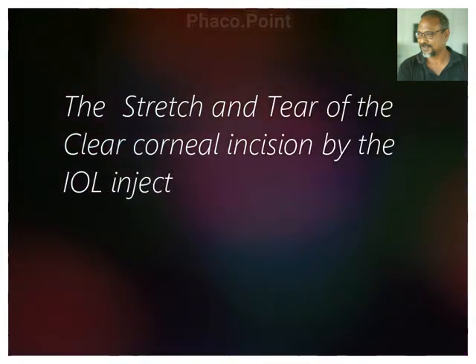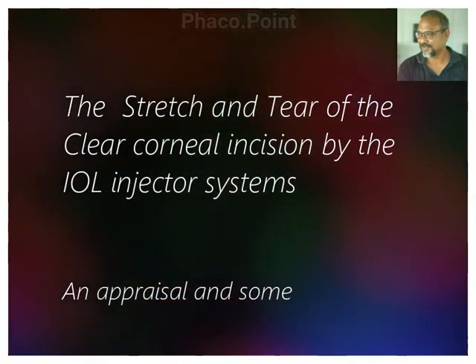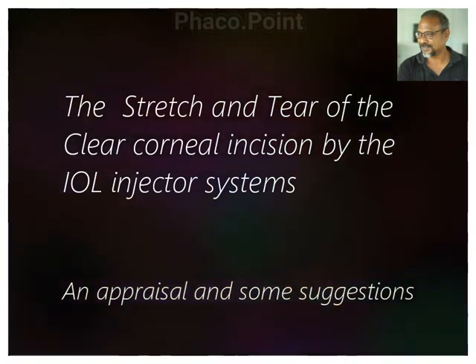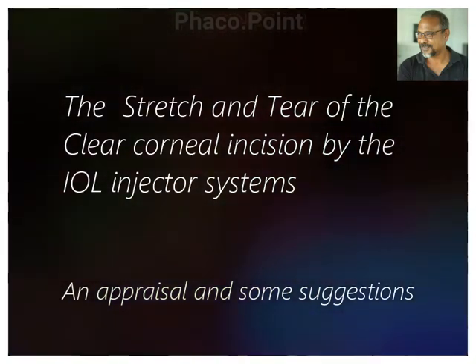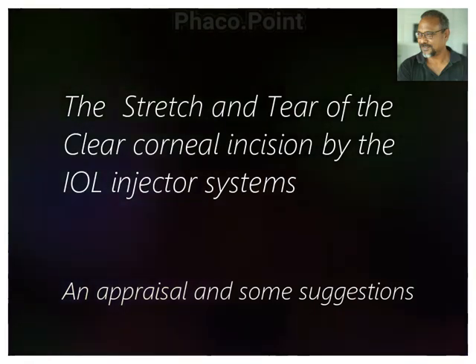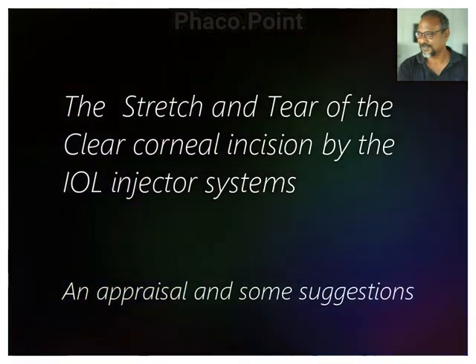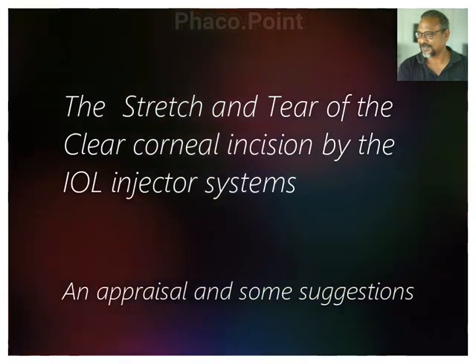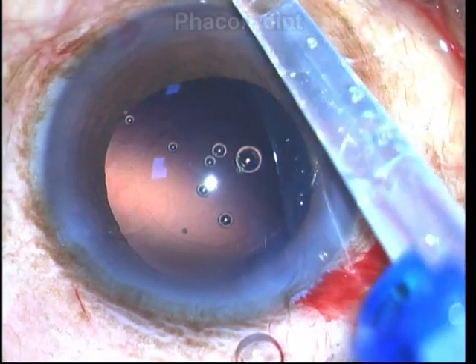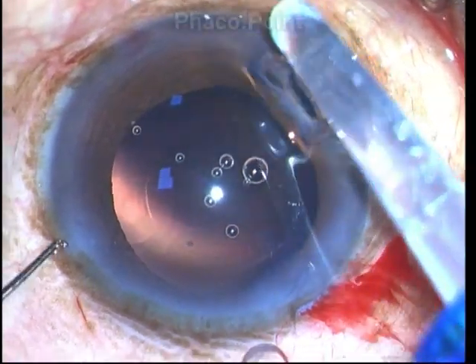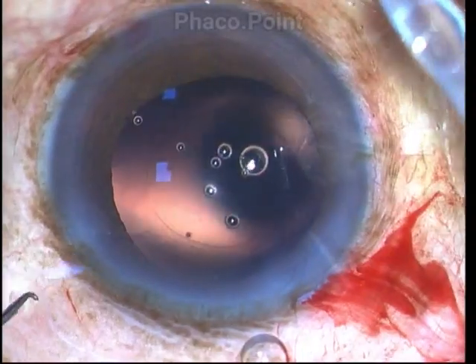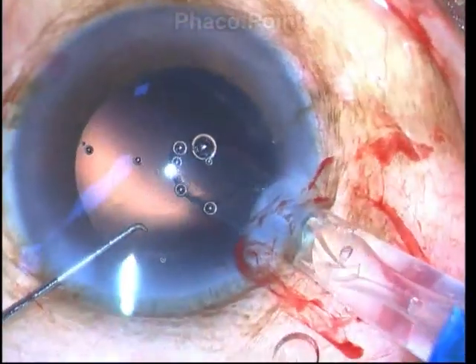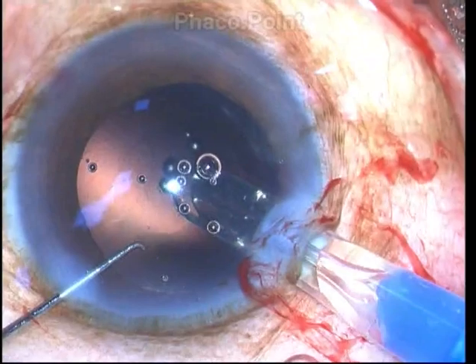Dear friends, in this video I will address the issue of the clear corneal wound stretch and in some cases possibly resulting in a tear during the injection of the foldable intraocular lens. Let's start with the visual of the injection of a single piece foldable hydrophobic intraocular lens being injected with a 2.8 mm cartridge system.